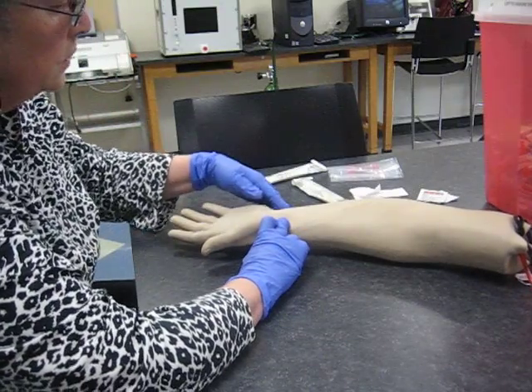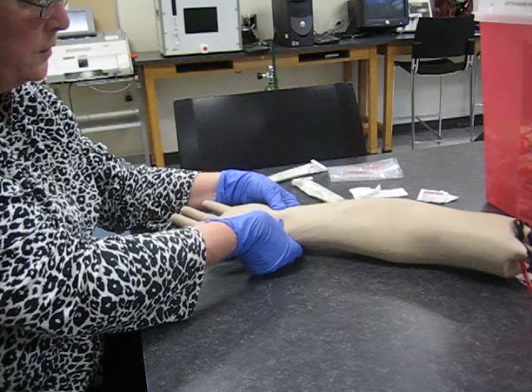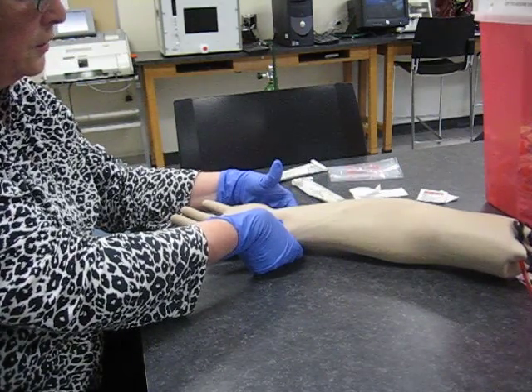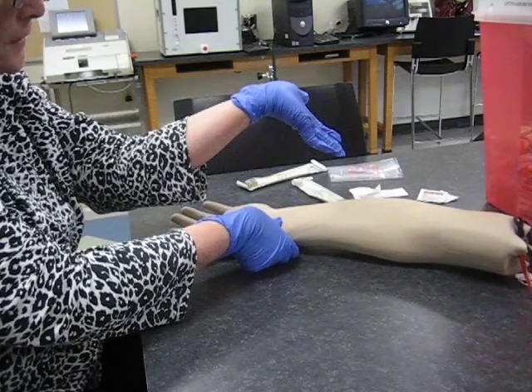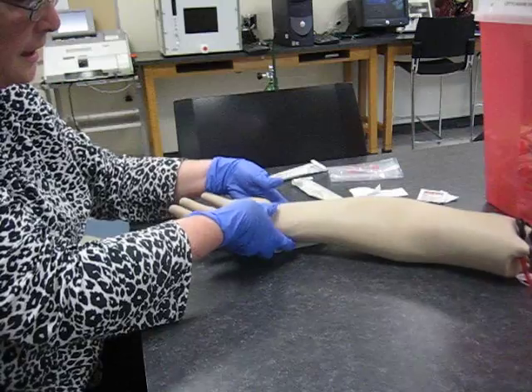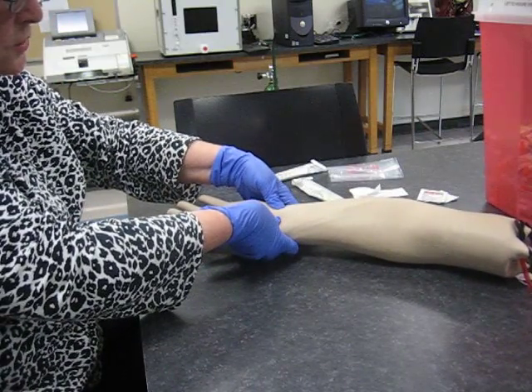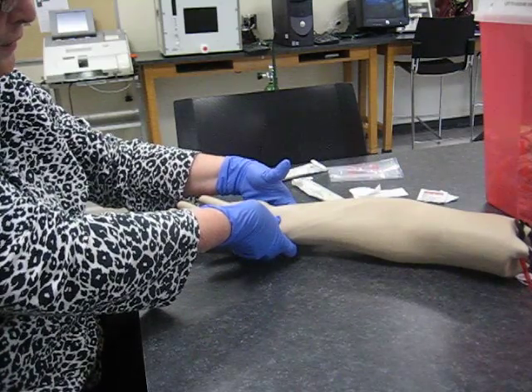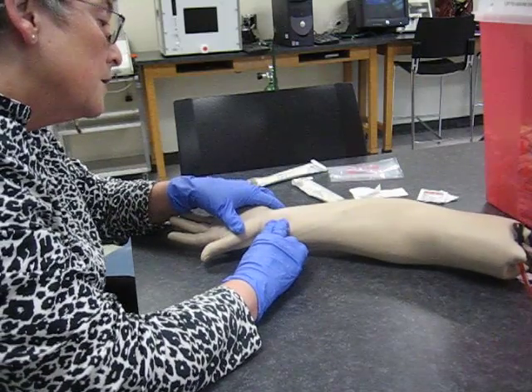Mr. Hand, what I need you to do is make a fist — I'm going to do an Allen's test. He makes a fist, he opens it up, I release the ulnar, he pinks up. Now if he doesn't pink up, he may have had his hand flip back too far. I hold it steady — I like to hold his hand with the back of my hand. Make a fist again, Mr. Hand, then hold it open with his hand relatively flat. He's pink, that means he has ulnar collateral flow.